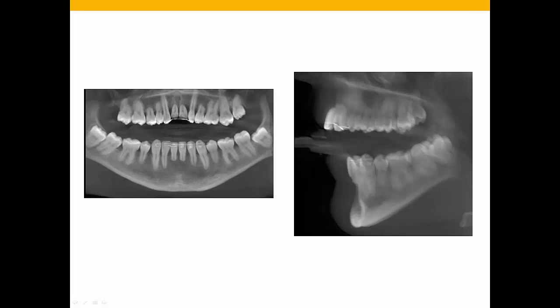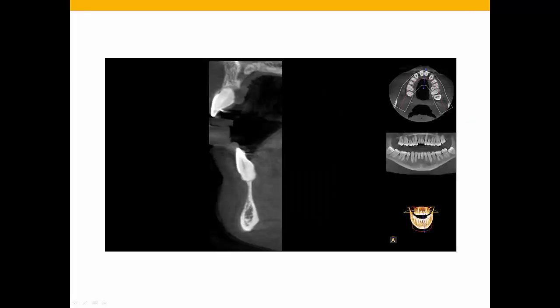We know that she's going to lose those upper centrals. You can tell from the reconstructed panorex that there's just no support for them. But what about the lower incisors? The lower incisors appear to have shortened roots, but how do they appear to be in terms of bony support based on the pan and the cephalometric x-ray we have here, or the reconstructed cephalometric x-ray? If you take a cone beam CT and slice down the center of the lower central incisor, you get a completely different view of the bony support for that individual tooth.